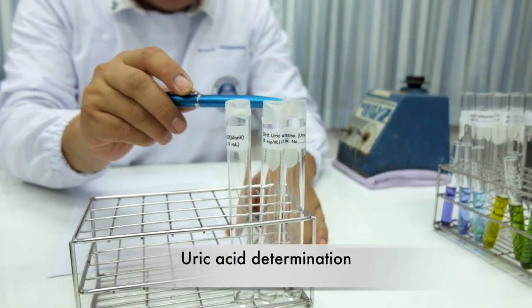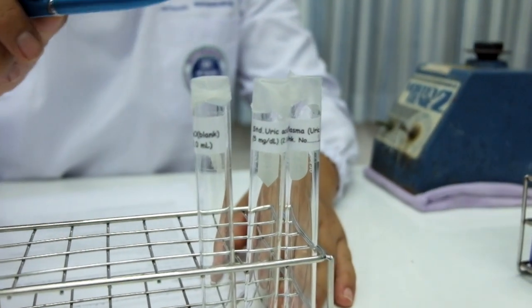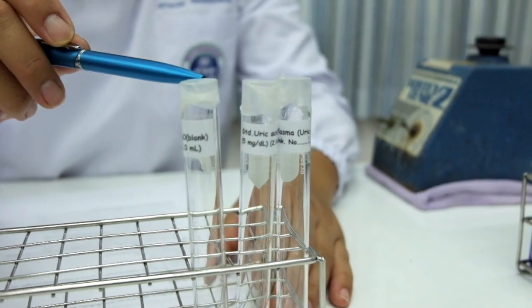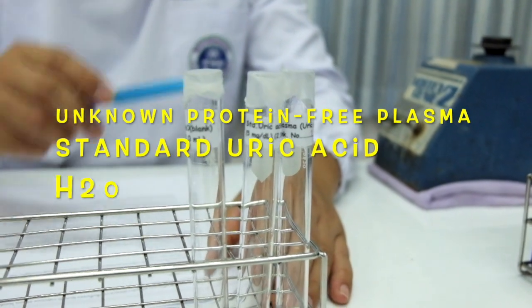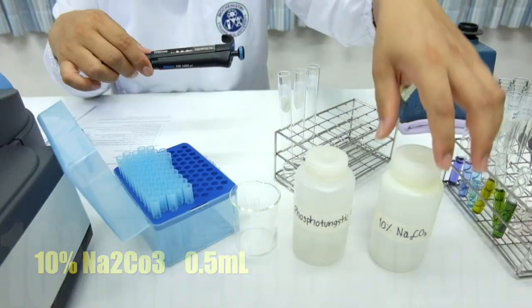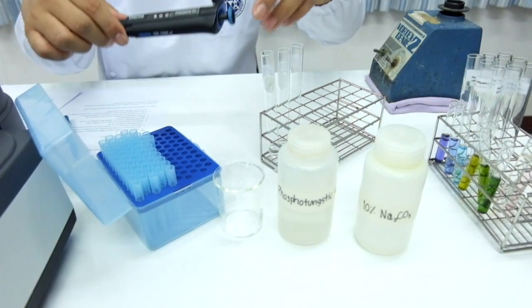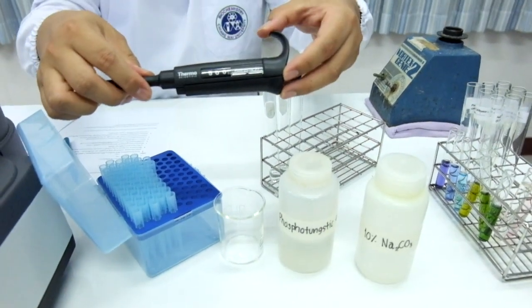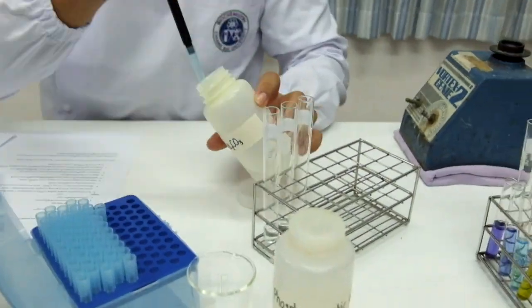Uric acid determination. For the uric acid analysis, you receive 3 test tubes containing 2 milliliters of protein-free plasma unknown, standard uric acid, and water. Fill 0.5 milliliters of 10% sodium carbonate solution into the tubes of the protein-free plasma unknown, the standard, and the water.